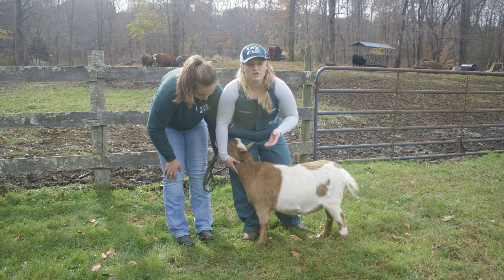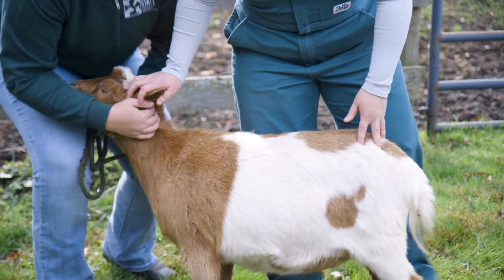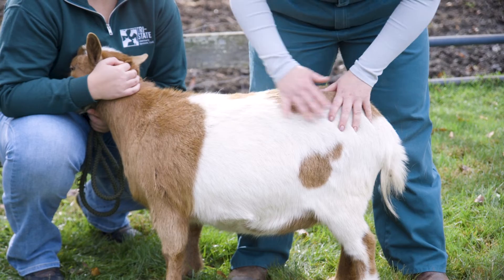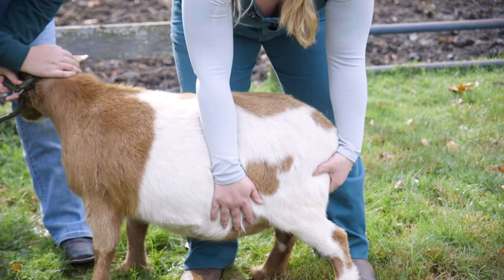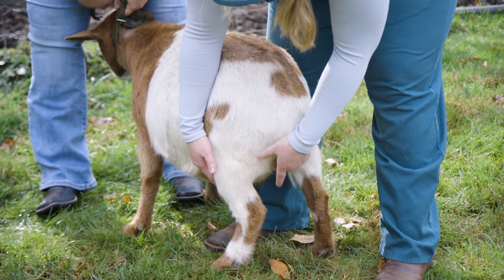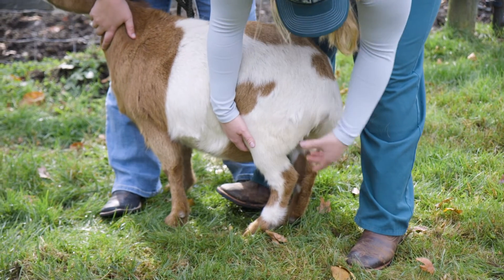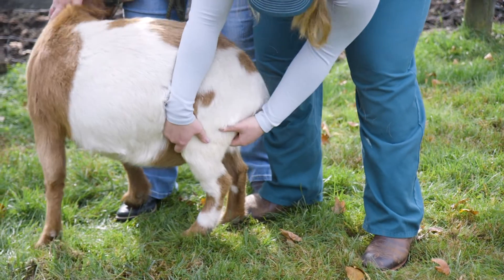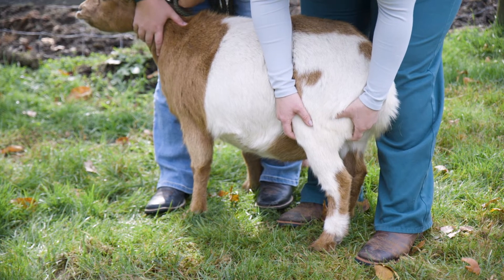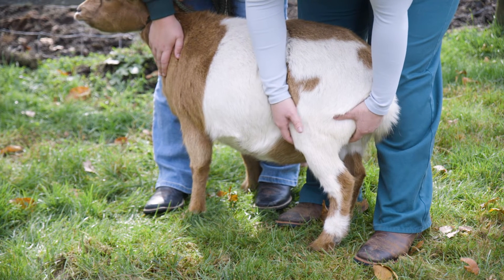Another area which I find to be a little bit more simple in small ruminants would be in the hind end. I find this a little simpler because you're not right up in front of them, so you can have somebody hold them a little easier, and we're dealing with the back of the leg muscle. If you take your hand and go behind the back leg and grab the muscle like this by holding this part of the muscle belly, what you're identifying is that hamstring area on the goat.